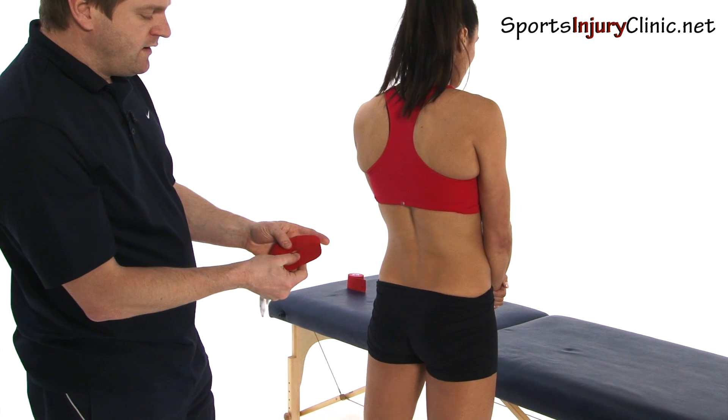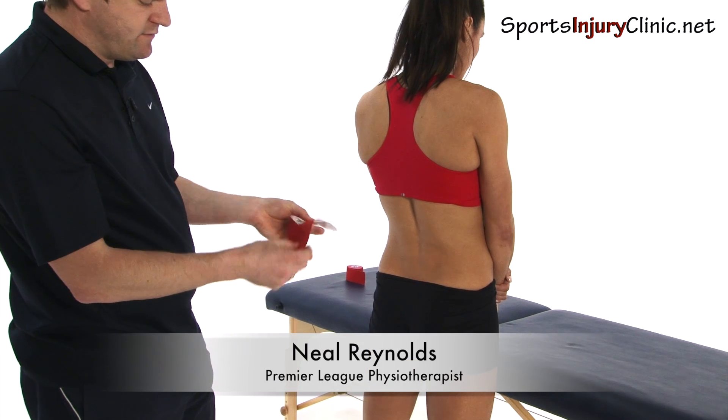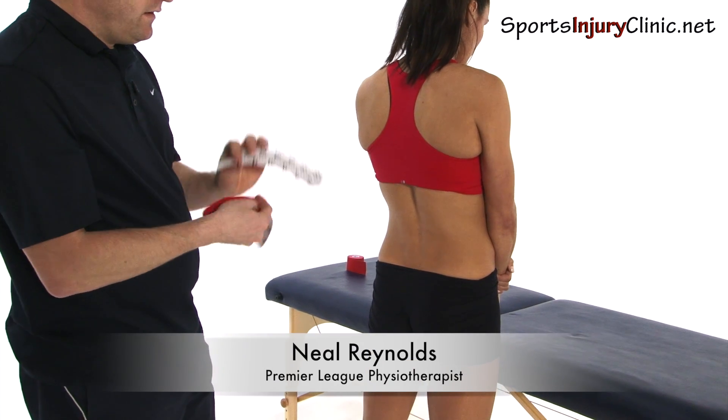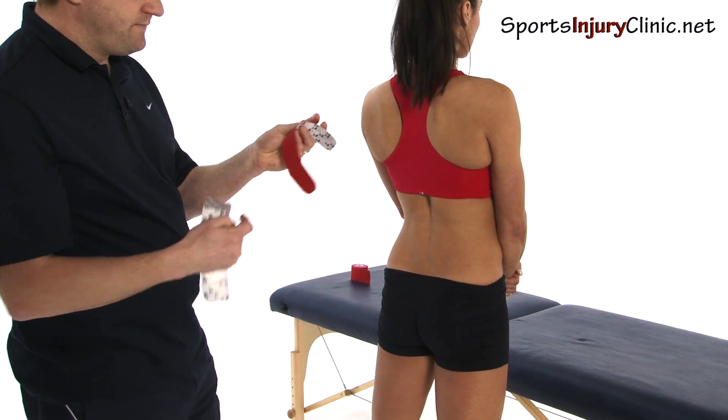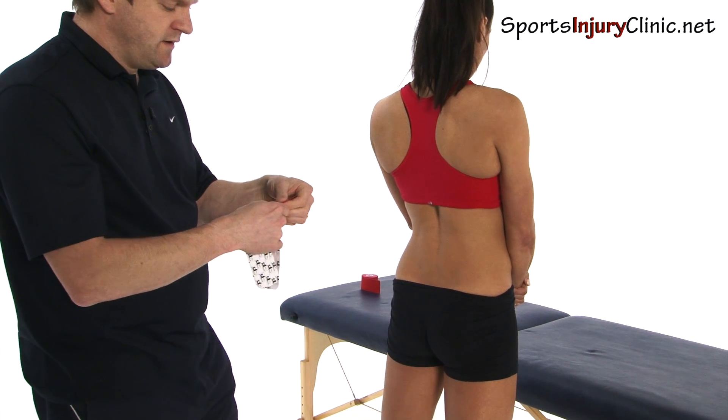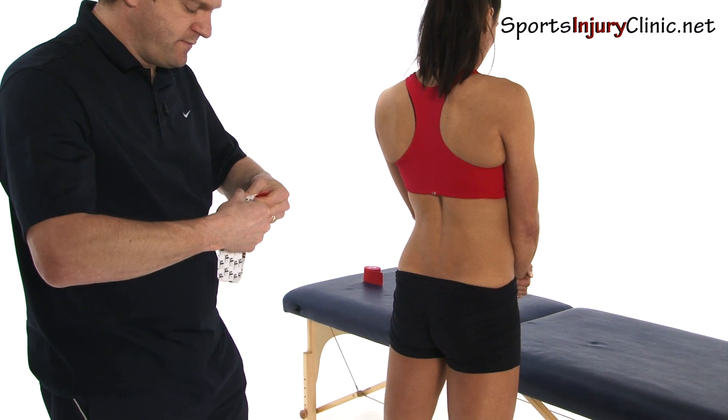We've got two strips of tape with no sharp corners, so rounded off edges at the end. The top quarter has been bent over like so. What I now need to do is rip along the area of the backing paper.